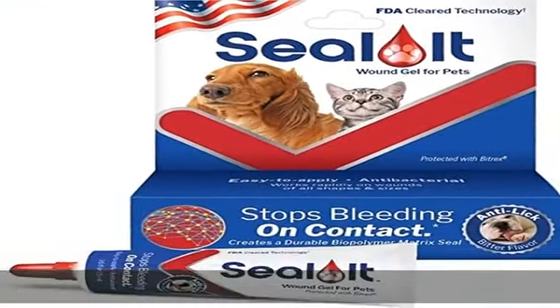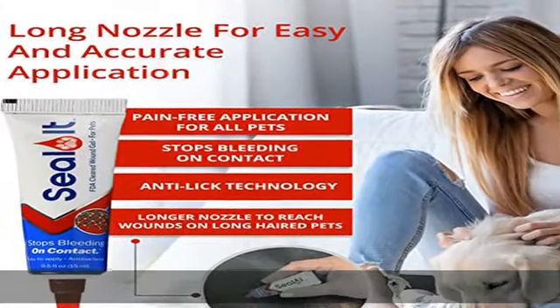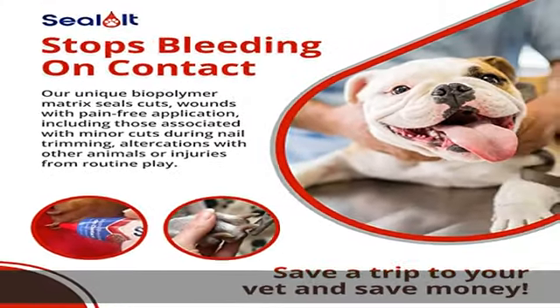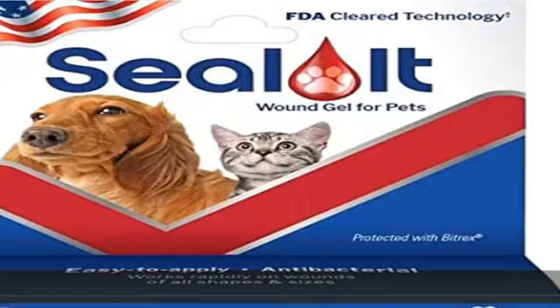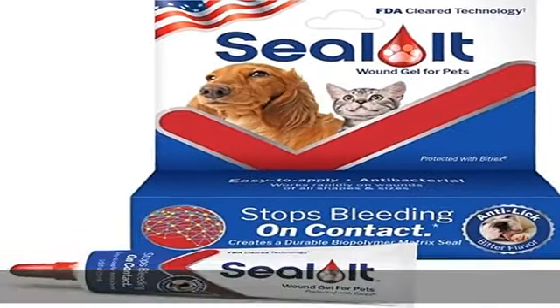Seal It is a high-performance hemostat blood management material and is an ideal first-aid go-to for your furry friend. With its fast-acting unique formula and anti-lick technology, Seal It has a unique biopolymer matrix that seals cuts, wounds, and scrapes on all types of pets and animals, including injuries during routine nail trimming.